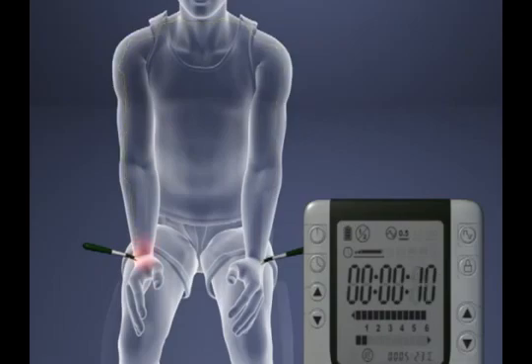For example, follow a line under and around each wrist, placing the probes at intervals along the line all the way around the arm below the wrist. Repeat as necessary, varying probe positions.